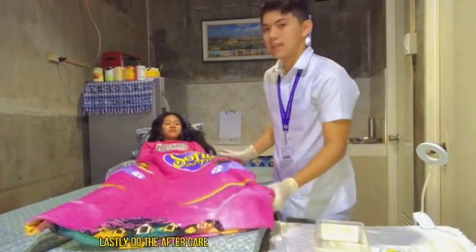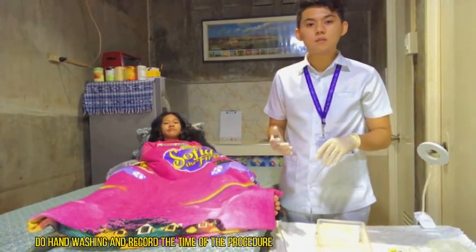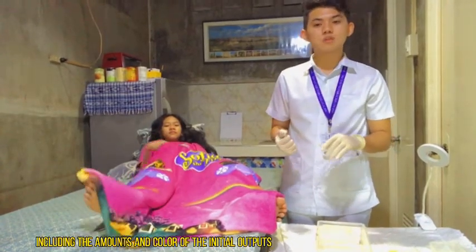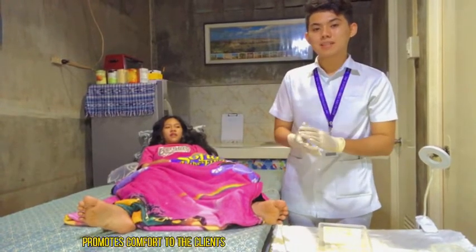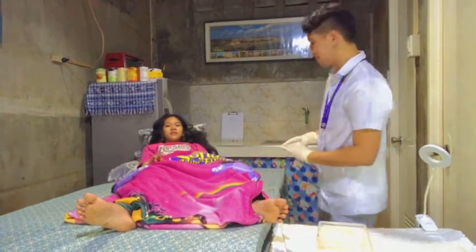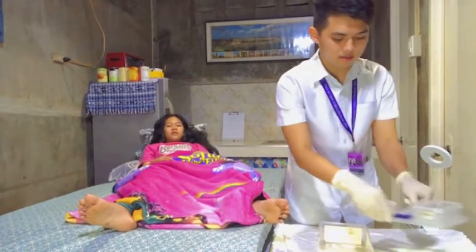So, lastly, do the aftercare, remove the gloves, do hand washing, and record the time of the procedure done, including the amount and color of the initial outputs. This is important because cleaning the environment promotes comfort to the clients, and documentation is important for future purposes.